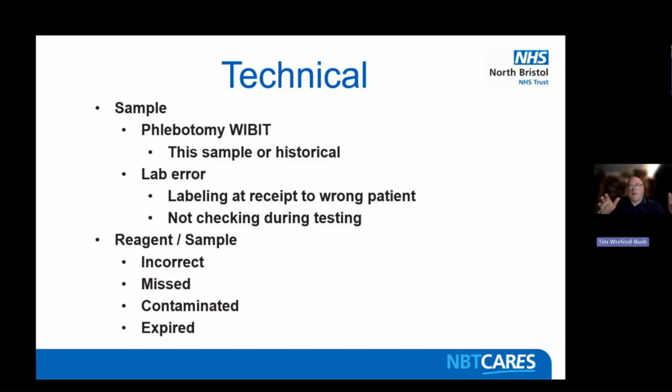So you might be booking in a couple of samples. I would not advocate this way, but you might book in 10 samples and label them afterwards. We always book in 1 sample at a time. But if you have done that, or you've picked up the wrong sample when the label comes out and you put it back on, you might put it on the wrong sample. So you've got the label of the wrong patient there. Or you may pick up the wrong sample.